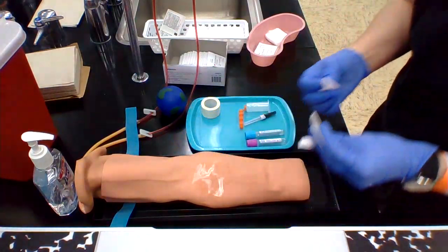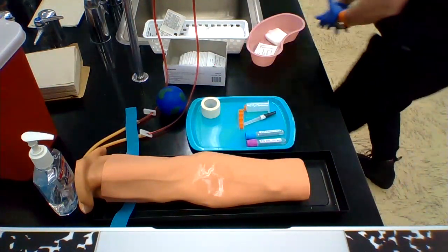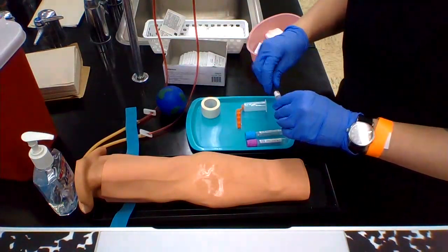Clean off your site, and while that's drying, you assemble your equipment.